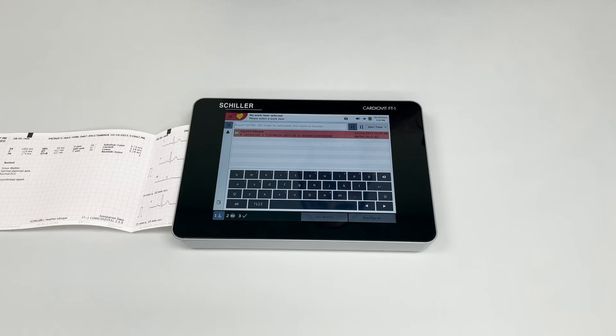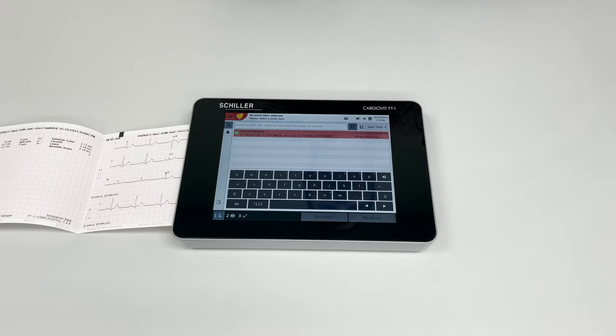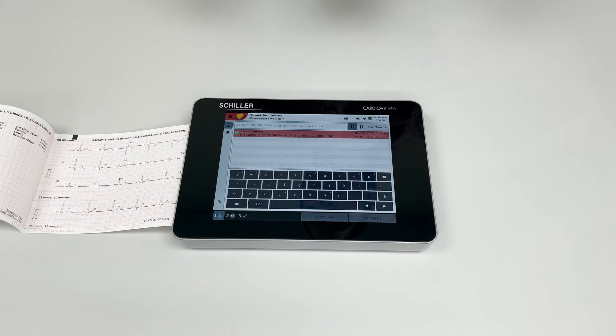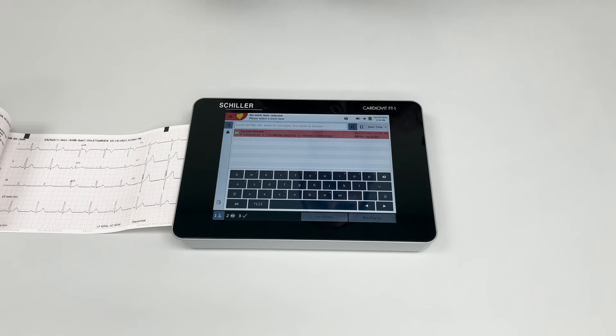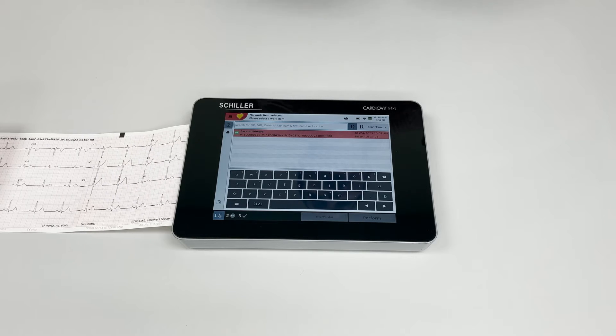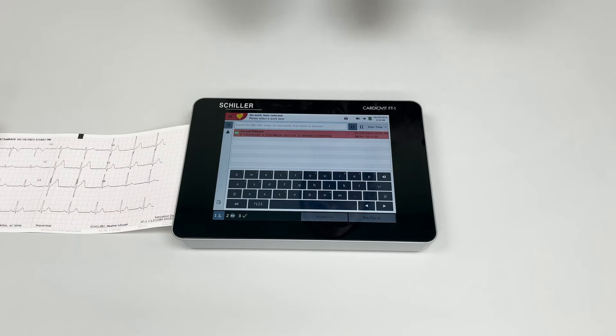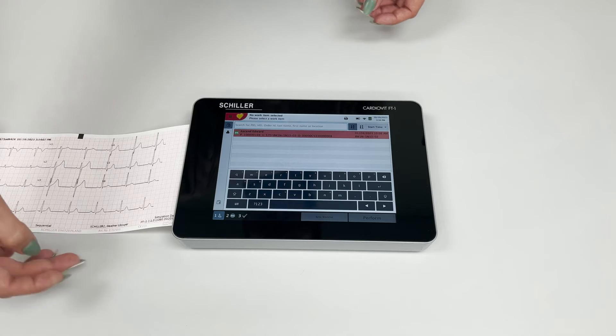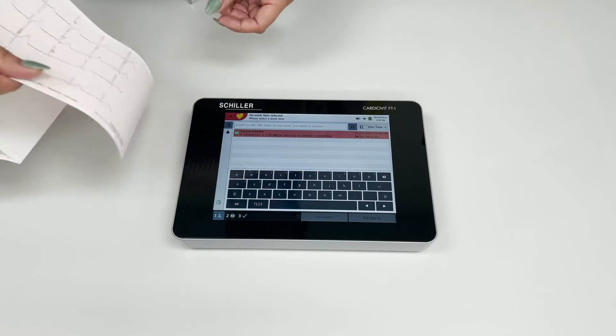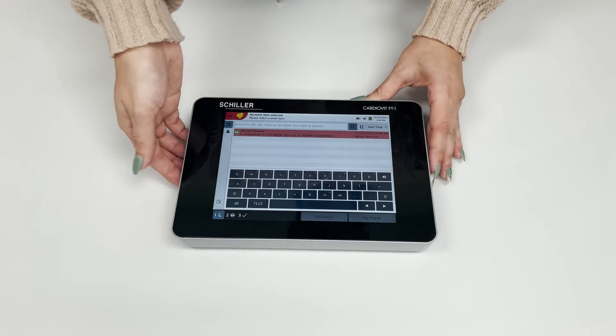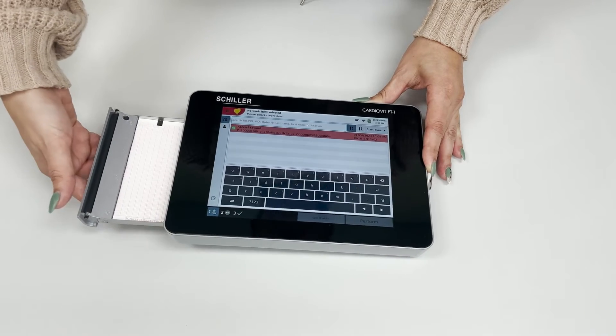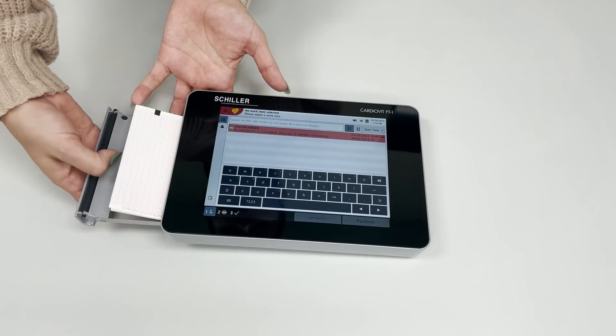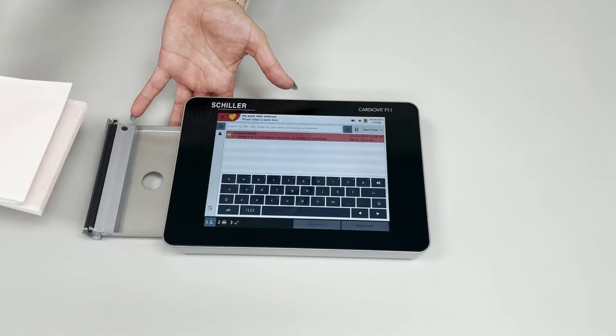There are times where customers call in and say that when they're printing, there is no print being printed on the actual paper.